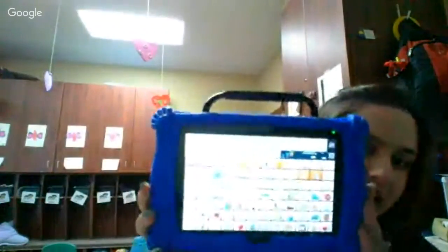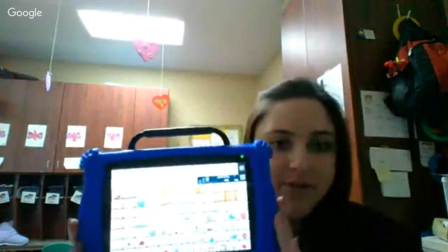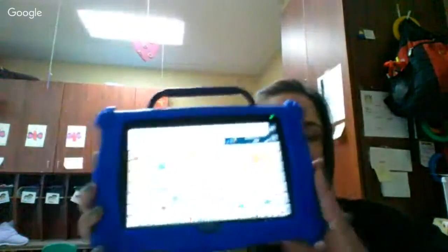I'm going to be talking today about a speech generating device, how one of my clients uses it, some advantages and disadvantages, and then the type of client that it might be beneficial for. So the device I'm going to be talking about today is the Accent, and on the device is the Words for Life program. So it looks like this.